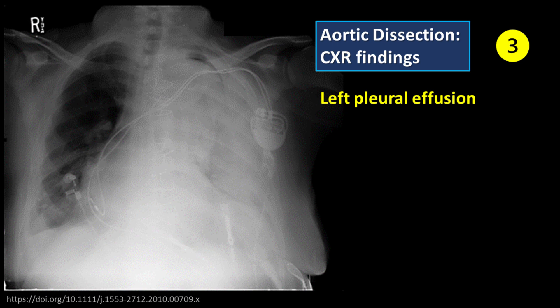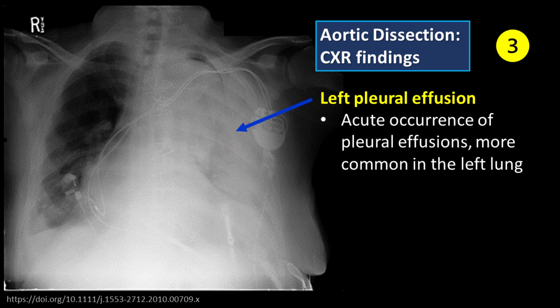Feature number 3: Left pleural effusion. Aortic dissection may lead to acute occurrence of pleural effusions, more commonly in the left lung.